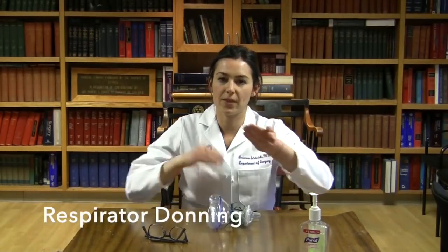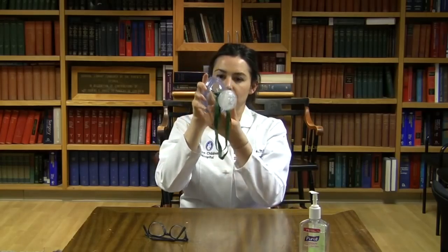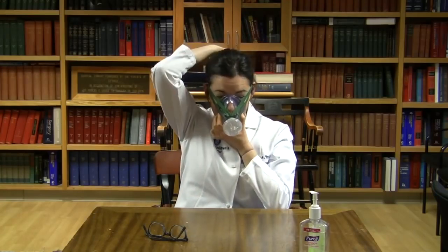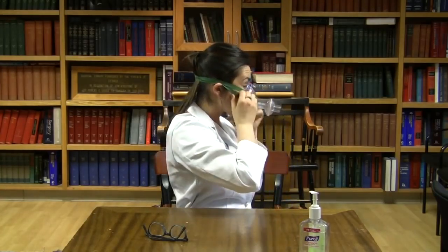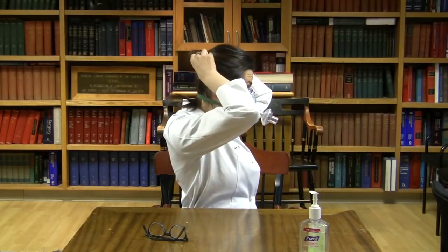Before you begin, make sure your hair is tied back. Perform hand hygiene. Loop the top strap over the filter so that both straps hang down together. Cup your hands around the cushion of the mask and bring it to your face. Pull both straps down and up over the filter onto your head. Now adjust the bottom strap so that it is positioned under your ears. Adjust the upper strap so that it fits comfortably above your ears. Now adjust the mask on your face and chin to assure a tight seal. It is helpful to pull the cushion out onto your face.